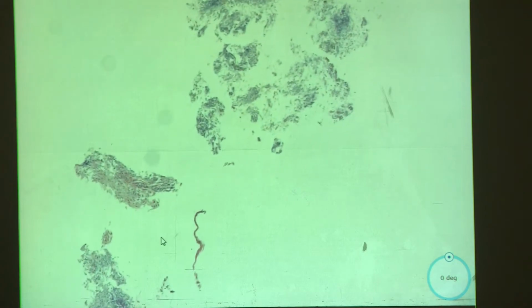And why is it not happy? Well, there's a lot of inflammation, a lot of erosion. It's kind of fraying at the ends here. Right? Yeah. That probably is the best piece on this. I mean, this one's pretty much destroyed over here. You're not even seeing any epithelium, so it could be an ulcer, it could just be a bad sample, we don't know, but lots of inflammation.